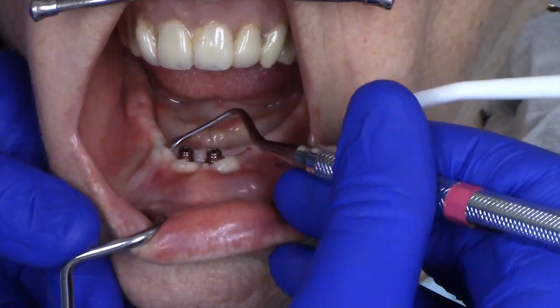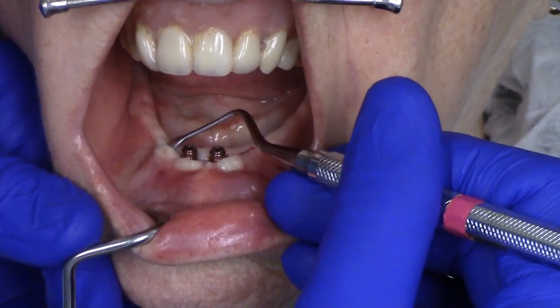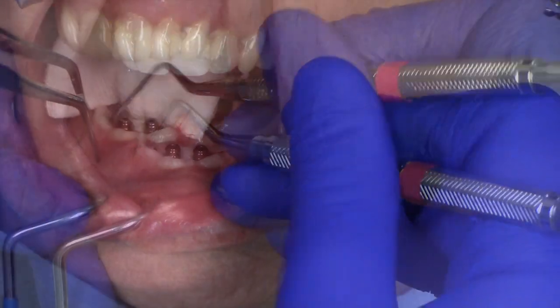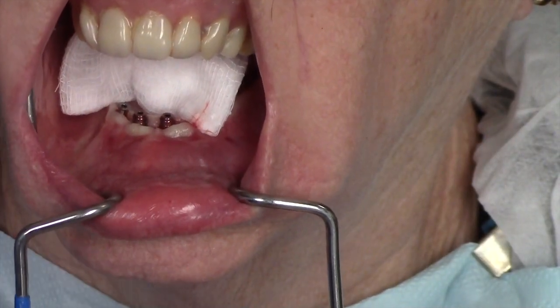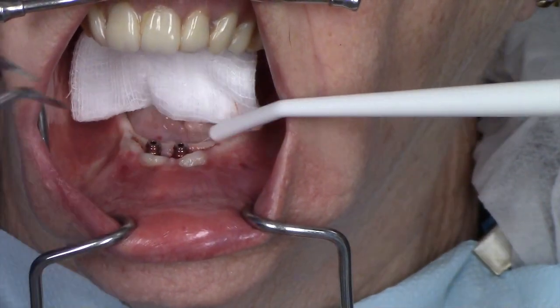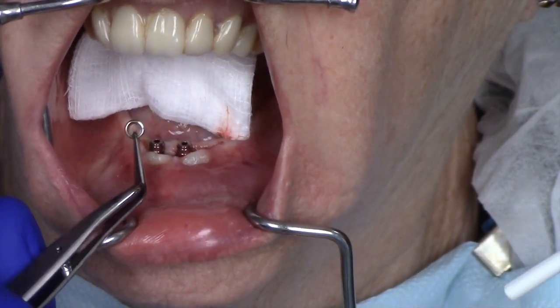Using the curette carefully will ensure that you don't tear the soft tissue that surrounds the dental implant. While not always possible, preserving the keratinized tissue around an implant is optimal. After carefully teasing the healing abutment apart, it is removed in two pieces. Sometimes it can be a little bit tricky to remove a healing abutment that has been buried underneath the soft tissue, as shown here.